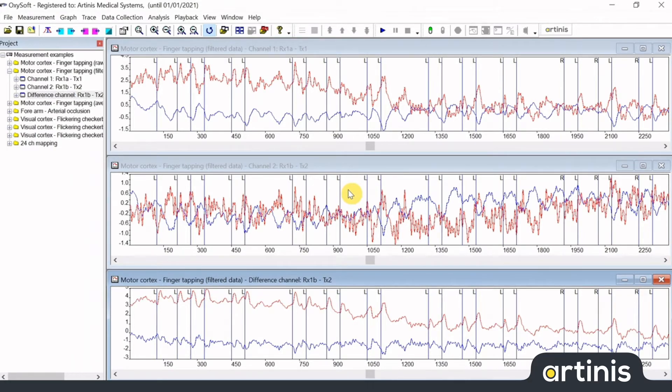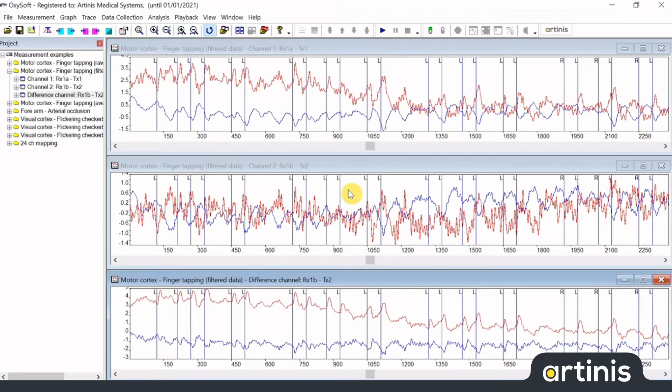Events will help to analyze measured data. You can use them as indicators in a cyclic operator, or use the labels of events instead of a specific time in seconds during exportation of your data.